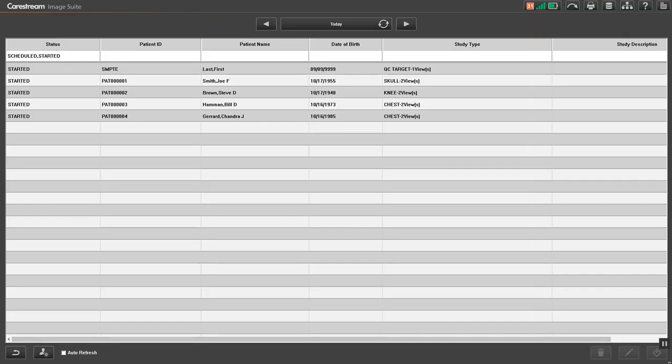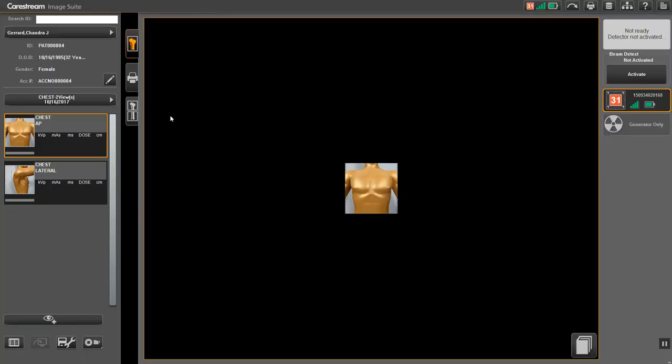To acquire an image in the Beam Detect mode, select a patient from the worklist. Select a view and select a detector if not already selected.